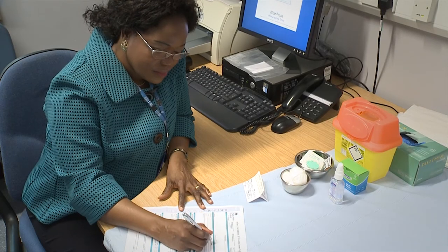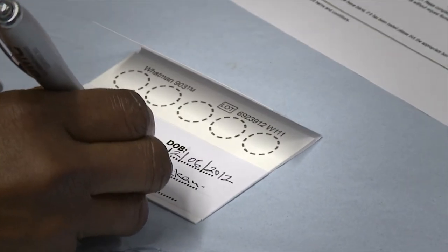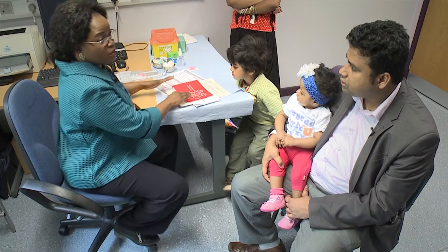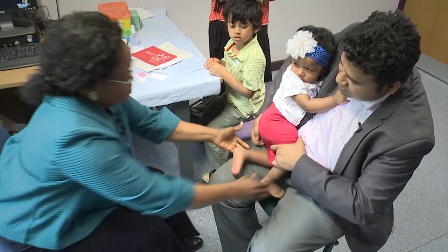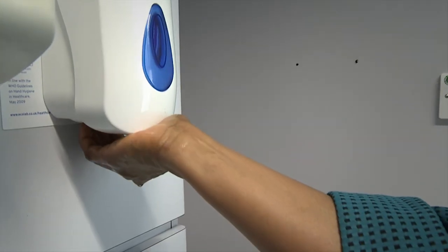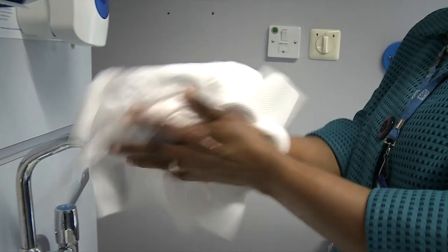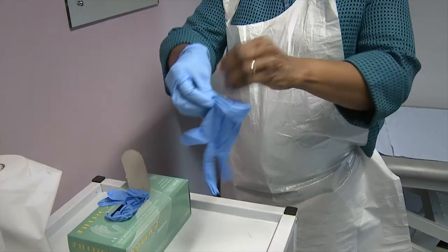Once you have all the equipment, record and complete all the sections on the infant hepatitis B virus request form and dry blood spot card. Encourage the parent to place the infant in a comfortable position with the infant's foot bare and accessible. Wash your hands thoroughly using liquid soap and water, then after drying apply appropriate PPE, including apron and gloves.